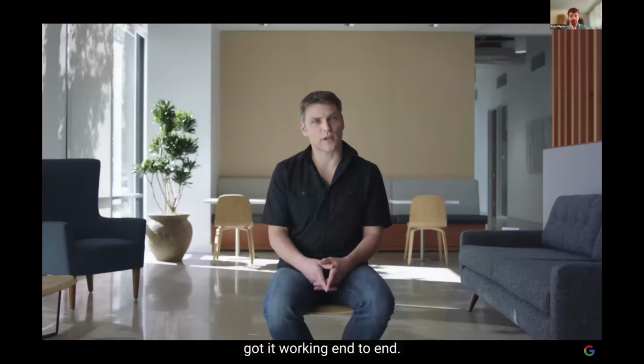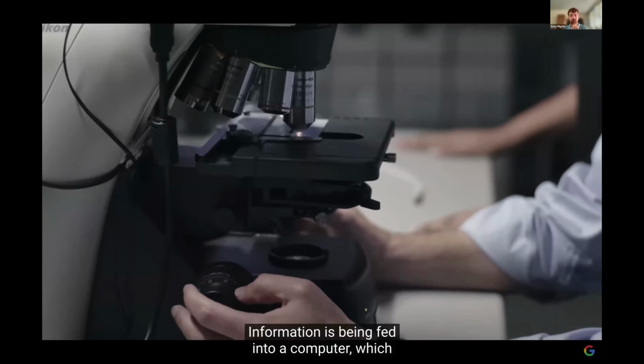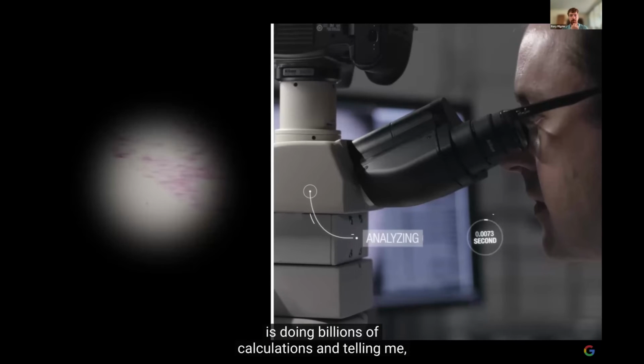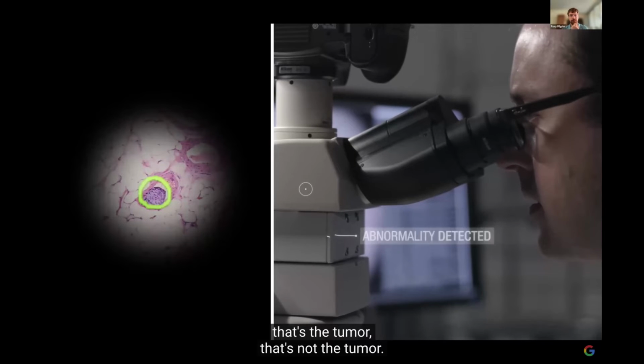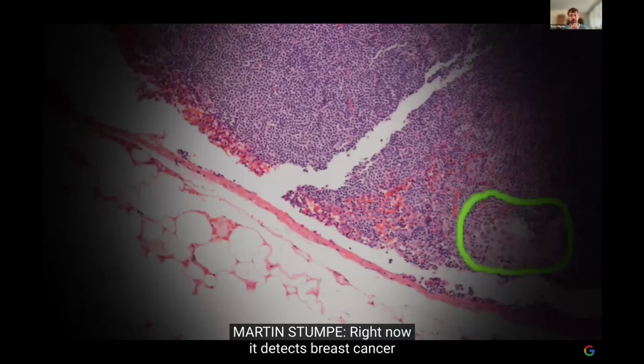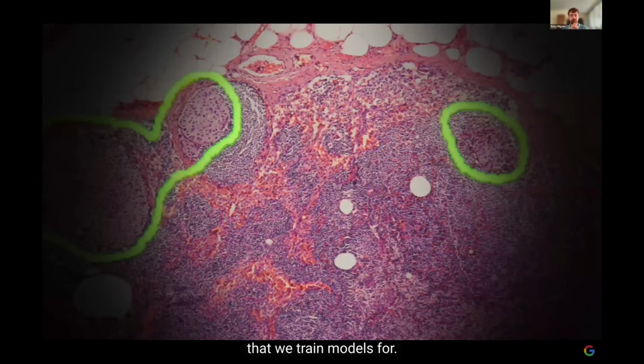Just a few weeks ago, we got it working end-to-end. It has a camera, so it's seeing the same thing I'm seeing. Information is being fed into a computer, which is doing billions of calculations and telling me that's the tumor, that's not the tumor. Right now, it detects breast cancer and prostate cancer, but it could also work on any other cancer type that we train models for.